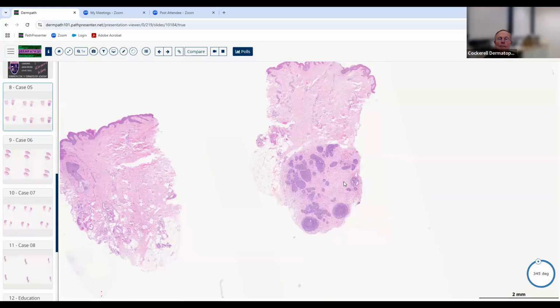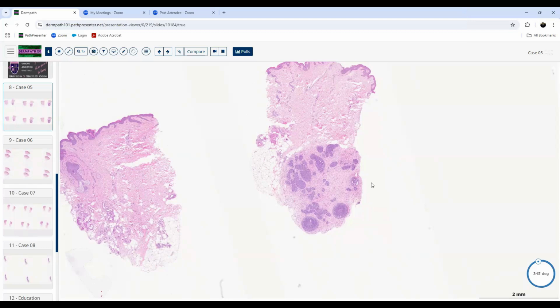Good, excellent, stroma. Now, when we look at this thing, you said it's well circumscribed. Mainly the thing that's well circumscribed is that stromal component, right? Kind of interesting. The stroma is probably contributing a significant component to this lesion. And what do you think they felt clinically when they saw the patient in the clinic? I potentially felt that this was maybe some form of follicular tumor.